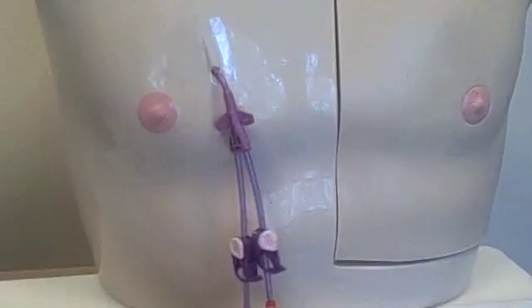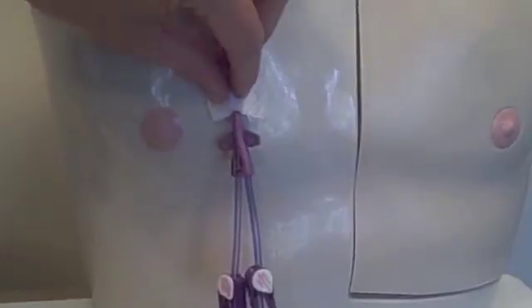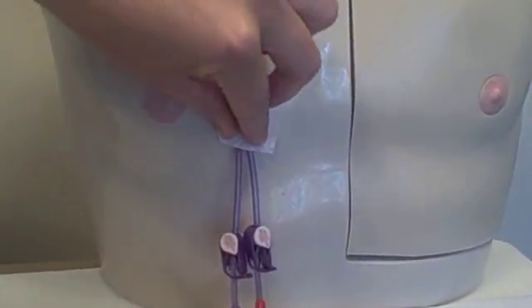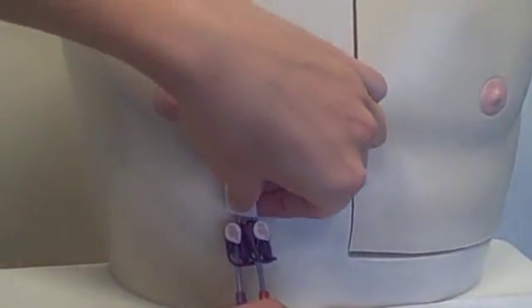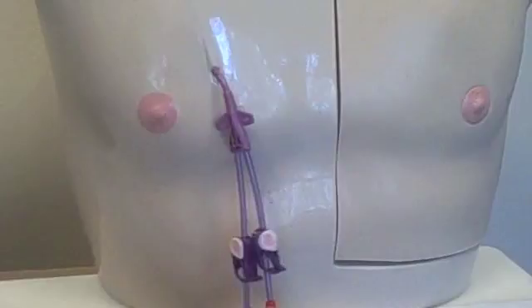Use the last alcohol wipe and wrap it around the catheter to gently clean it. Start at the insertion site and move along the catheter away from the chest and towards the catheter lumens. Do not pull on the catheter and do not go back up towards the insertion site.